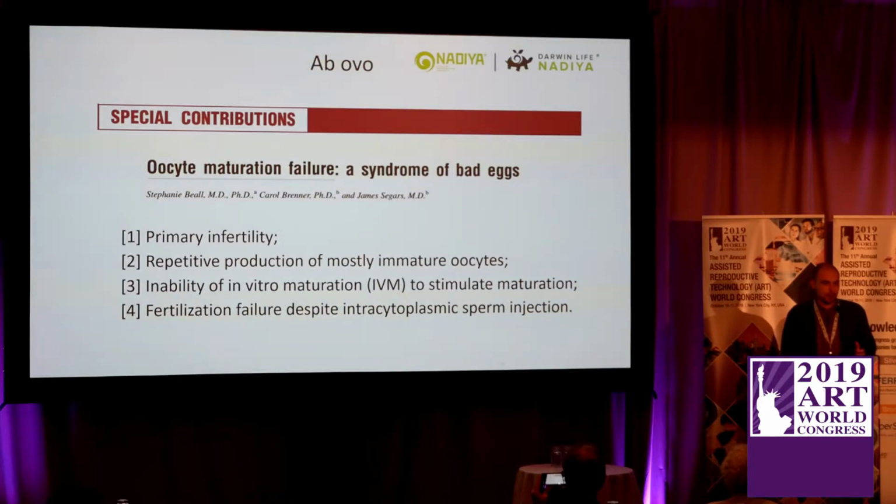So it's another type of maturation failure, because her oocytes cannot be arrested at the M2 stage. So we need to propose that she go back to maturation, and propose an M1 spindle transfer or GV transfer, or we can use polar body transfer.